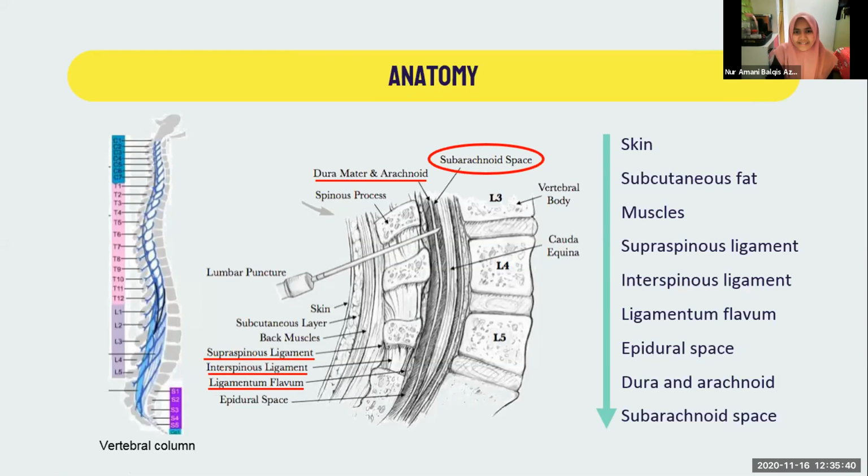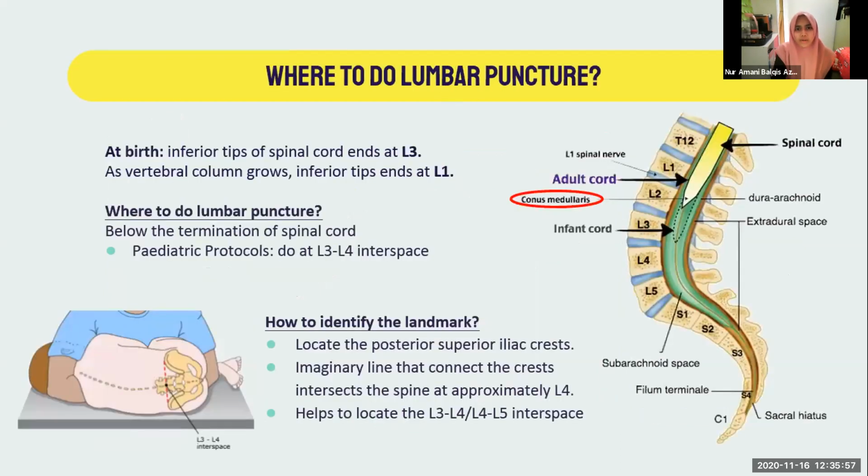No. Okay. After we pass through the ligaments, we will reach the meninges, and then we will reach the subarachnoid space in which the CSF is. So CSF is what we are trying to extract in this procedure. So, proceeding, where do we do lumbar puncture?